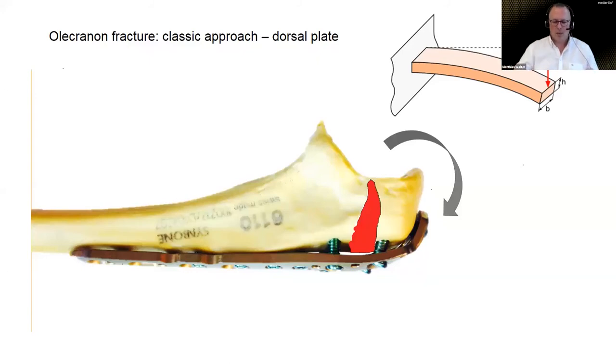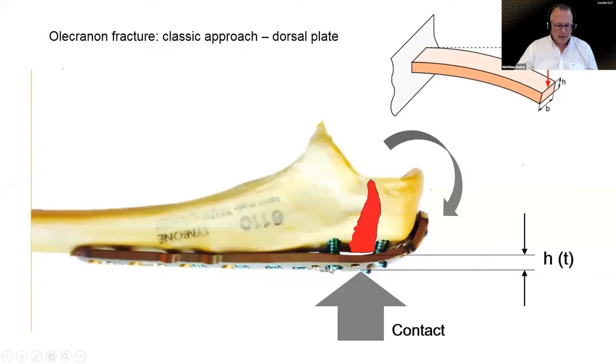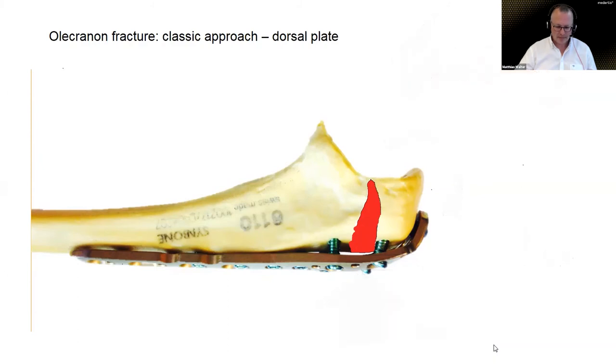So that's one of the points here. Your plate has to have a certain minimum height, because titanium or steel only comes in a certain material strength. So you can only counter the forces by beefing the material up, making it thick and heavy, okay? And the other thing is obviously what I mentioned before, you have all the contact load on your table, wherever you get in contact. So the metal is now always in the way between your table and your bone. So it's very disturbing in that respect.